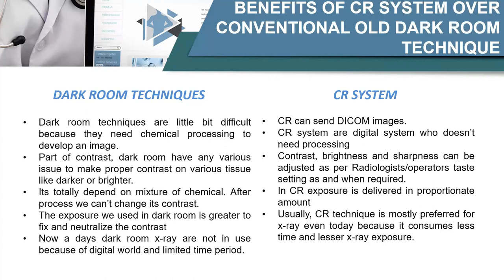Part of contrast in the darkroom, it varies actually. We have to make some hassles to get proper contrast. Contrast here in CR system can be adjusted manually by technicians using the computer. And the quality of the image in darkroom system is totally dependent on the mixture of chemicals. In CR system, we don't need that.